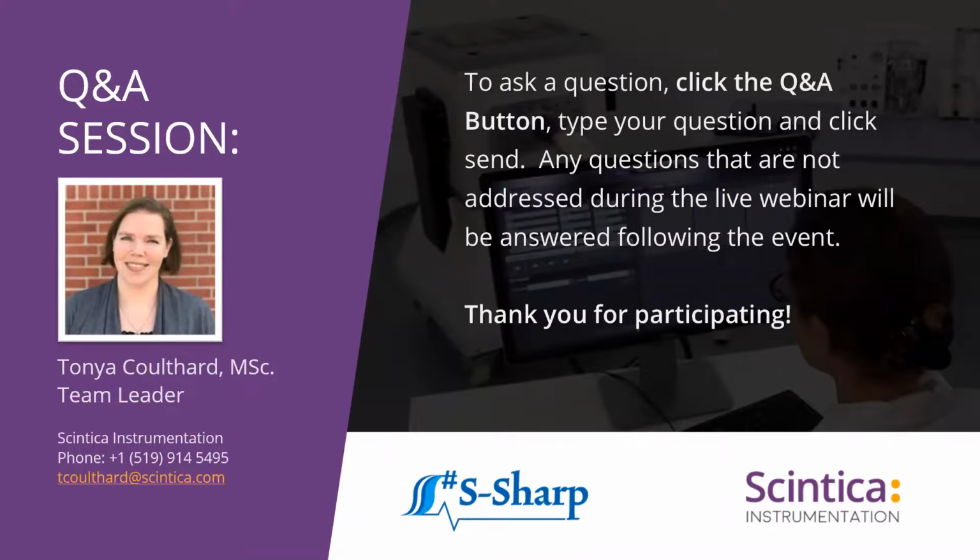Perfect. Okay, and the next question that came in is what is the maximum range and minimum step size of the 3D motor that you introduced to us? For sure. As we saw, that motor mounts to the side of the animal handling platform. The maximum range of that motor is 30 millimeters or 3 centimeters, and you can select how far you want that stage to move based on the target that you're looking at. The minimum step size is 0.05 millimeters, so quite small. And again, you can increase that if you want the acquisition to be faster and you're not as concerned about the out-of-plane resolution.